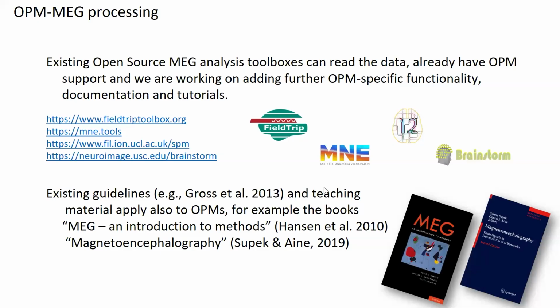So existing open source MEG analysis toolboxes can read the data, and they already all have support for OPMs. And with the respective projects, we are working on adding further OPM-specific functionality, documentation, and tutorials. So I'm the main developer of FieldTrip, which has very good OPM support. It's something that we're using. We have OPM tutorials already on the website, but I know that also the MNE, the SPM, and the Brainstorm teams have OPM support, have OPM documentation, and I really encourage you to adopt those toolboxes rather than to try to develop your own toolbox from scratch, because there's just so much overlap between SQUID-based and OPM-based MEG.